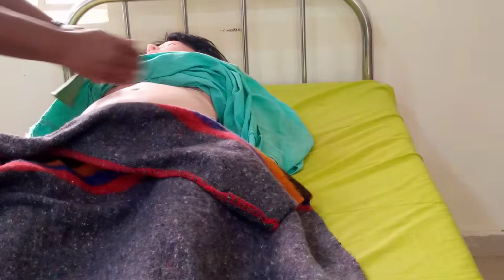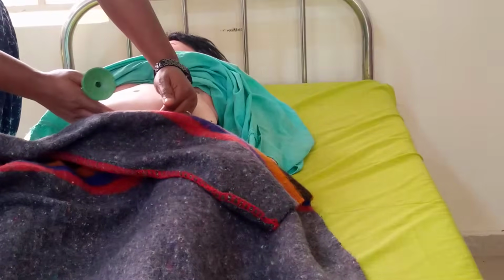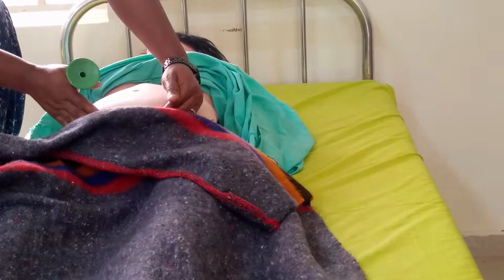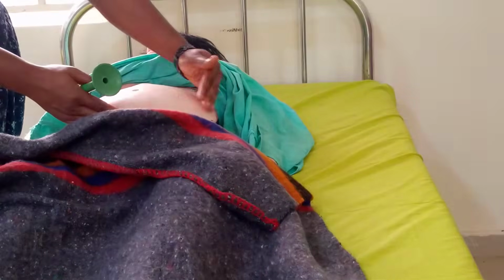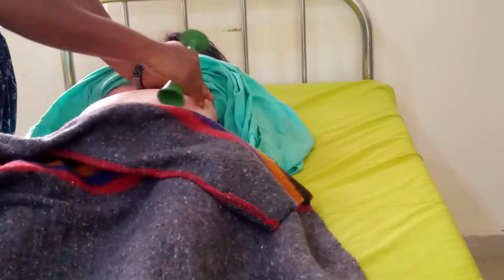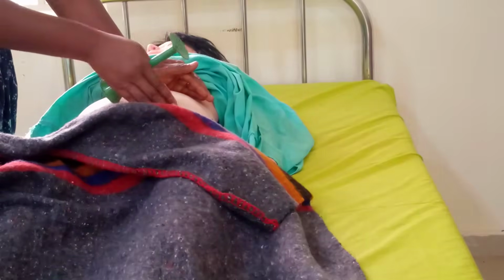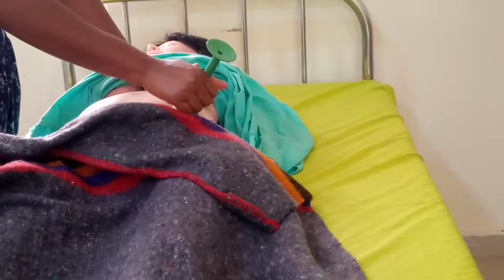Now we got our back at this end, and we assume that we got our head, especially if you get your head at the pelvic region, and the back is here. So you are going to be placing this pinard stethoscope in between the scapulae of the baby. So you know the anatomy of the baby, the back, after the head, you should be able to identify where you are supposed to get the scapula of the baby.